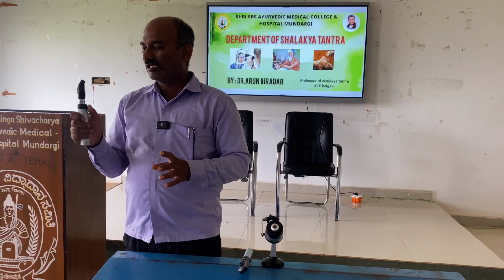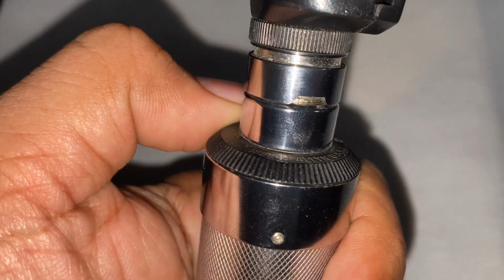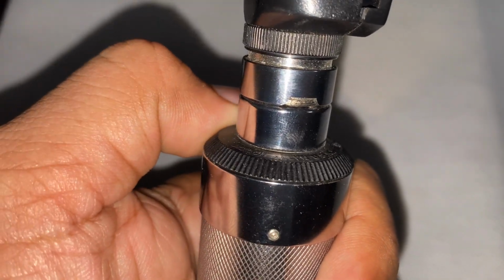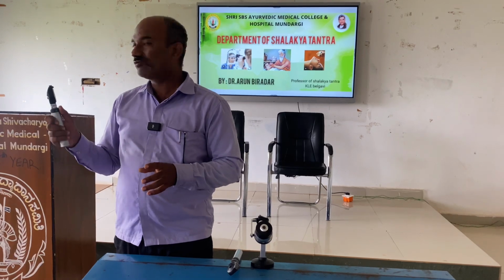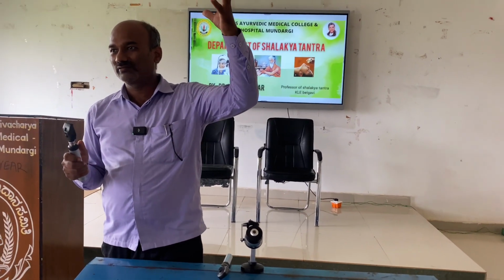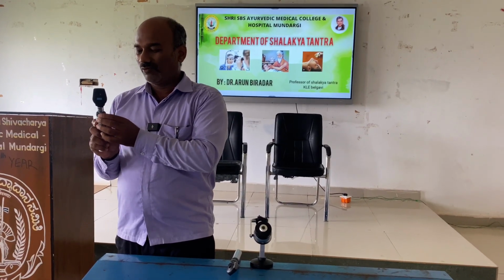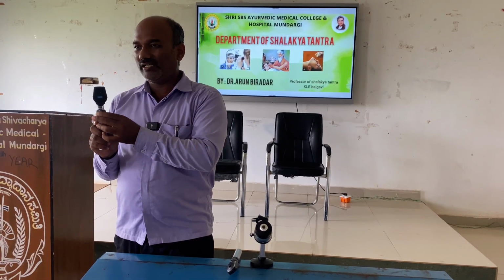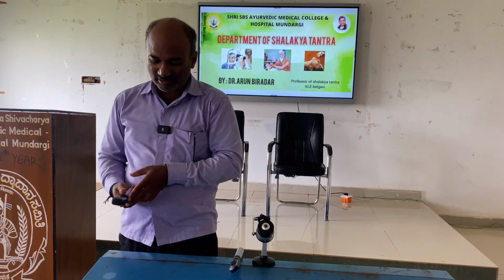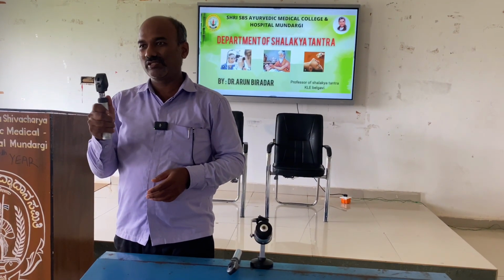Body has a rotating switch. This switch is called the illumination adjustment power switch. We have a switchboard here, right. You simply put on the switch, you will get the light. But this switch is a bit different. Hold it and gently rotate it. As you move, the intensity of the light changes. So intensity adjustment power switch, right.